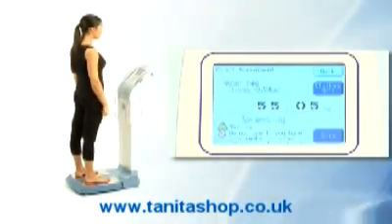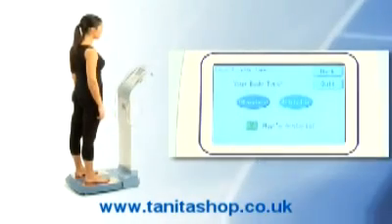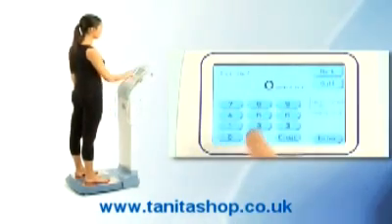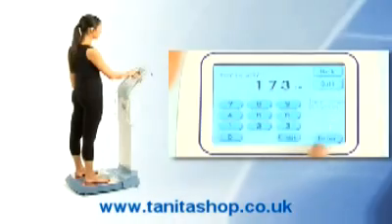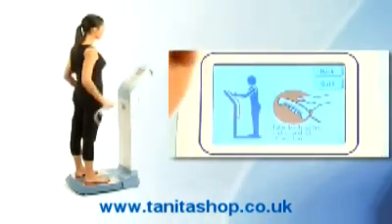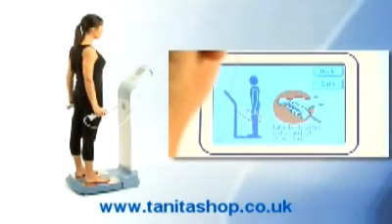A weight measurement will be taken. Then select male or female, select standard or athletic physique, and input age and height. Take hold of the four hand electrodes to complete the body composition reading in just 20 seconds.